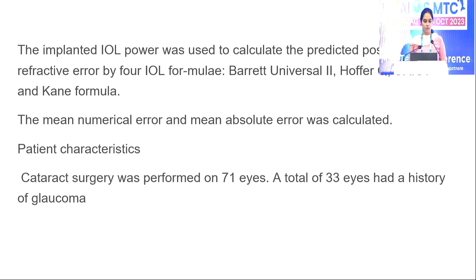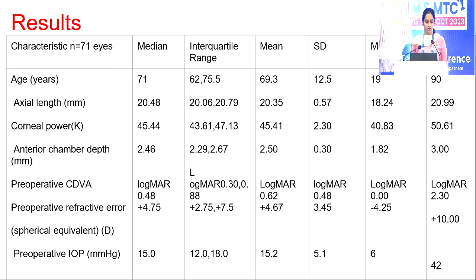Cataract surgery was performed on 71 eyes. A total of 33 eyes had a history of glaucoma. It is a retrospective study.